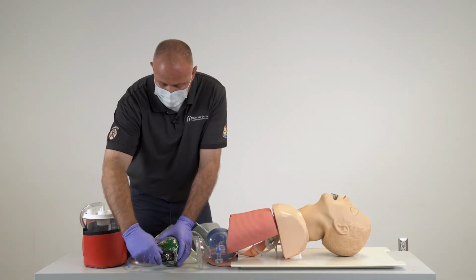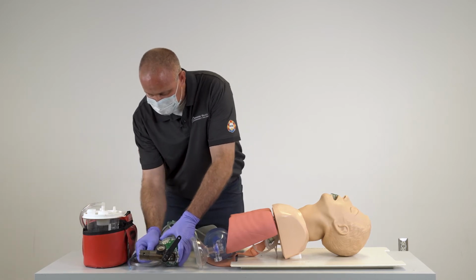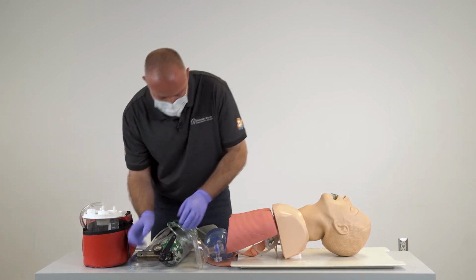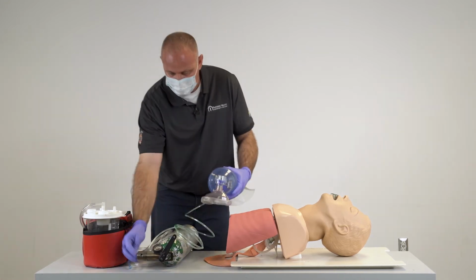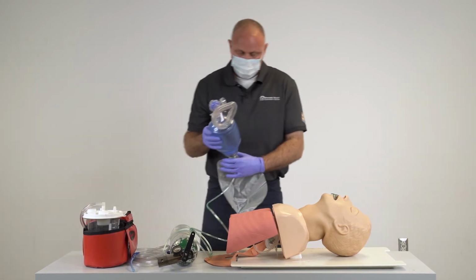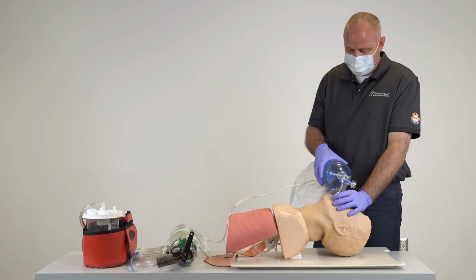I'm going to turn my bottle on. I'm going to hook up my tubing to my oxygen port. I'm going to turn it to 15 liters a minute. Now I'm going to ventilate my patient once every 6 seconds.